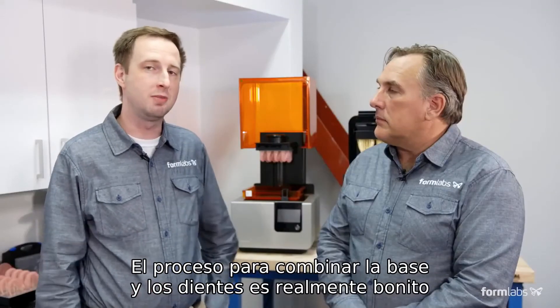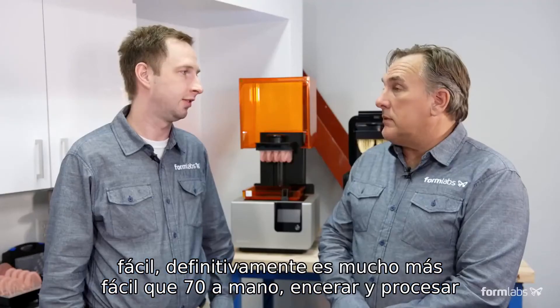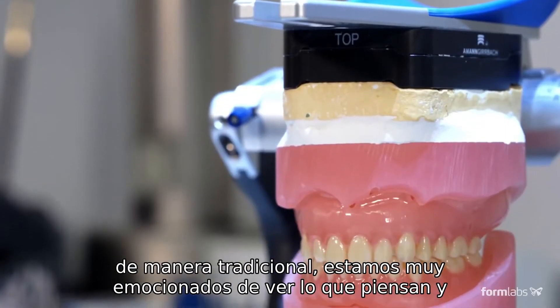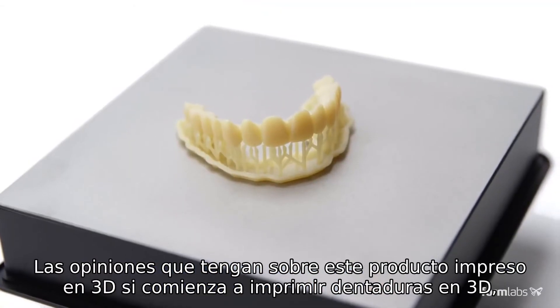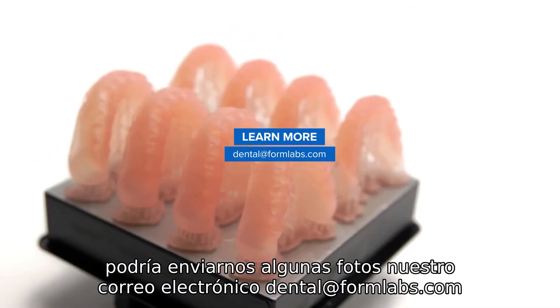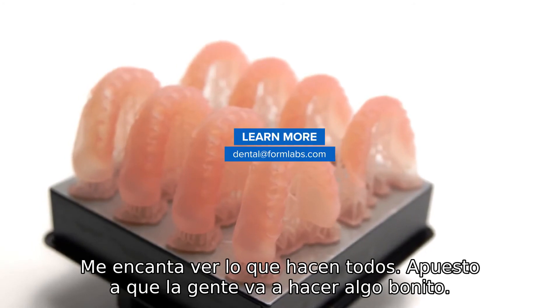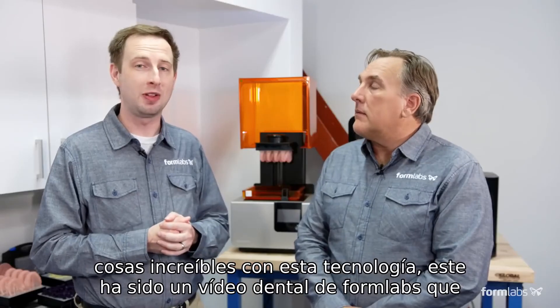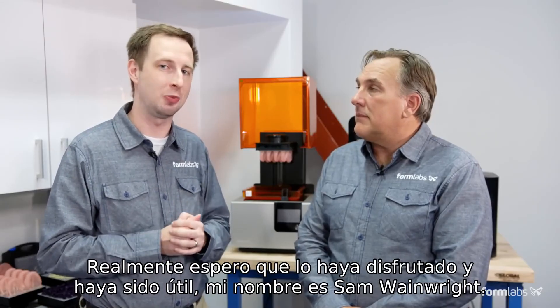The process to combine the base and the teeth through bonding is actually pretty easy — definitely much easier than setting teeth by hand in wax and processing in the traditional manner. We're very excited to see what everybody's thoughts and opinions are on this 3D printed product. If you start 3D printing dentures on your Form 2, send us some pictures. Our email is dental@formlabs.com. We'd love to see what everybody's doing — I bet people are going to do some pretty incredible stuff with this technology. This has been a Formlabs Dental video. We really hope you enjoyed it and it's been helpful. My name is Sam Wainwright, and this is Bill Slocum.